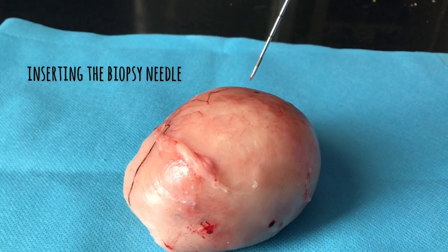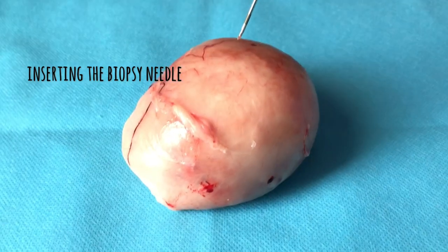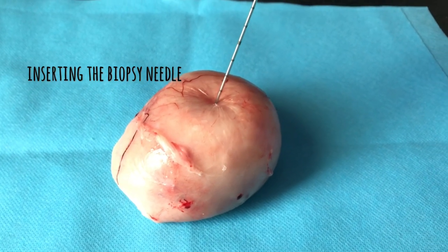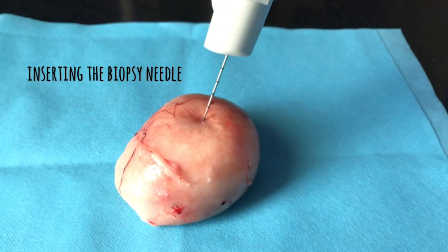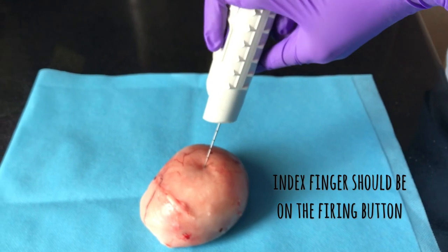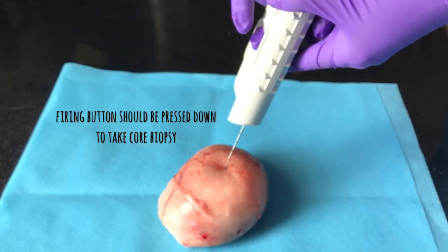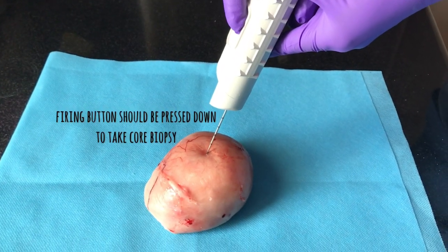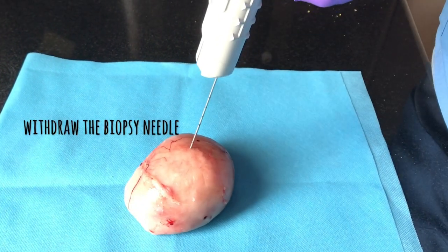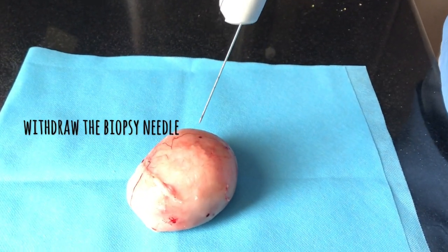Now I am inserting the biopsy needle, just like how you would introduce the needle to take fine needle aspiration cytology, but the only difference is you will not make a to-and-fro motion. If you notice carefully, my index finger is on the firing button so that when you press it you will be able to get a good biopsy sample from the tumour. As you can see, the biopsy is already taken.